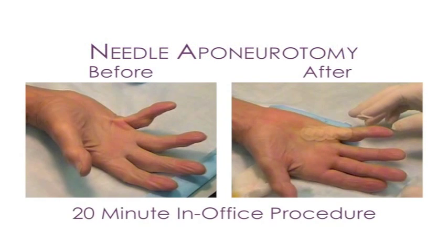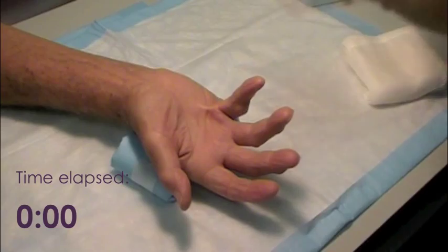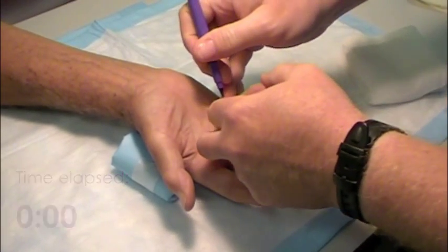This case presents a significant contracture of the small finger with a visible Dupuytren's cord. The points where the needle will be inserted are marked in preparation.